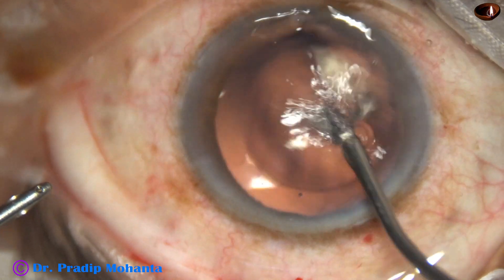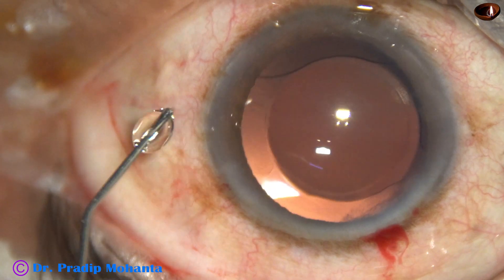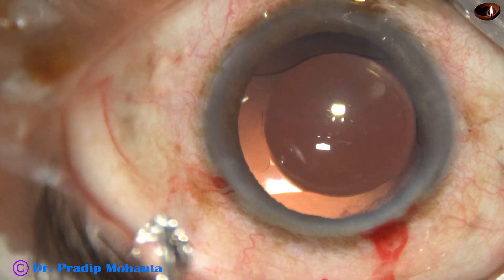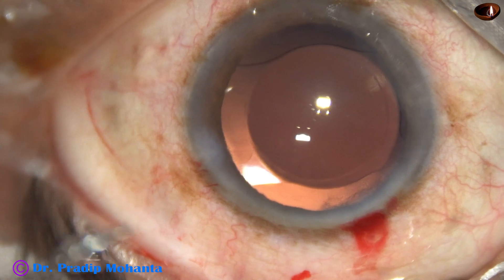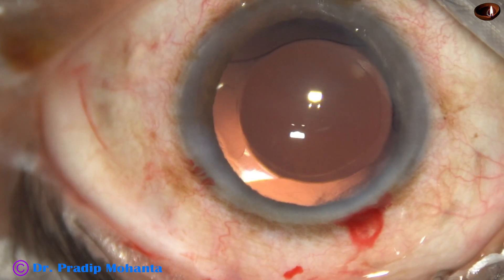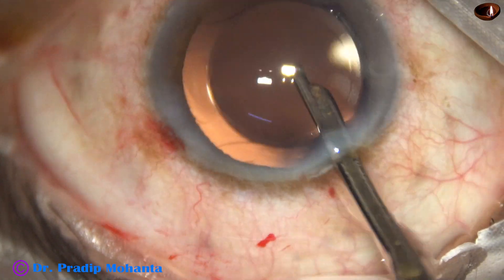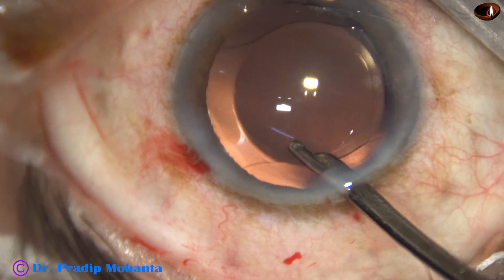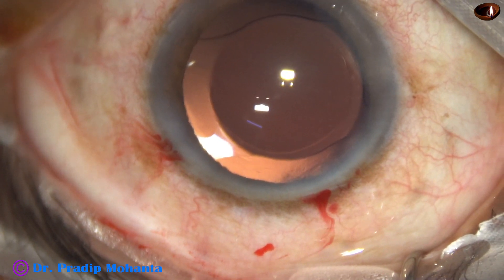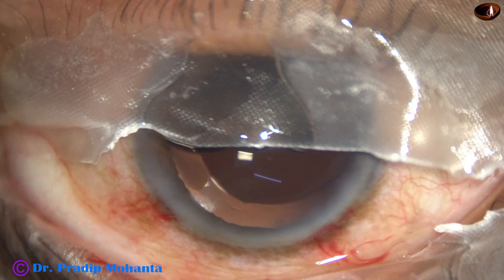Irrigation and aspiration used together — all the viscoelastic substance has come out. A bit of moxifloxacin is applied. Now I hydrate the corneal stroma and this side port gets closed. A final lavage of the anterior chamber is done and the anterior chamber is formed. We check the integrity of the wounds — there should not be any leakage from any side. Some moxifloxacin is applied over the ocular surface.